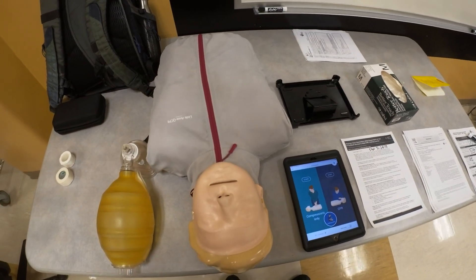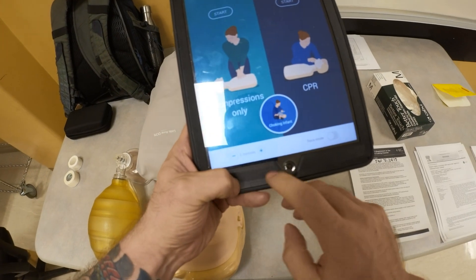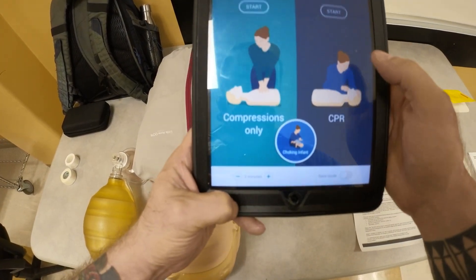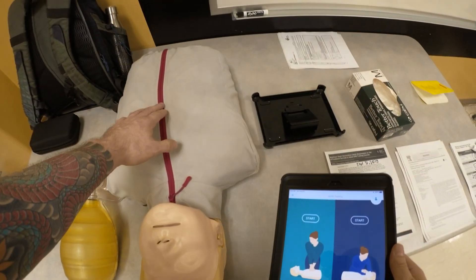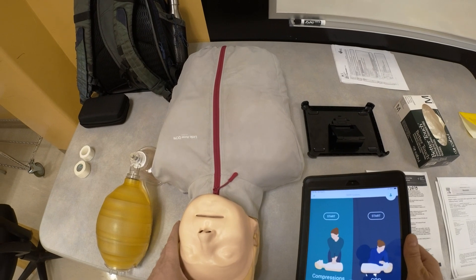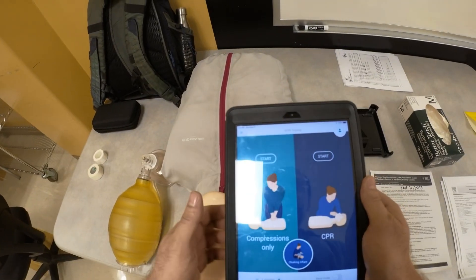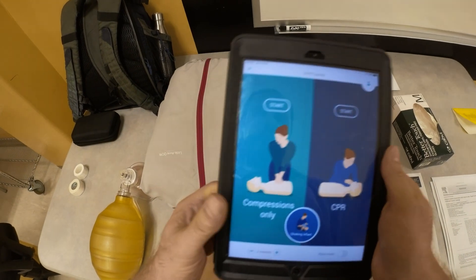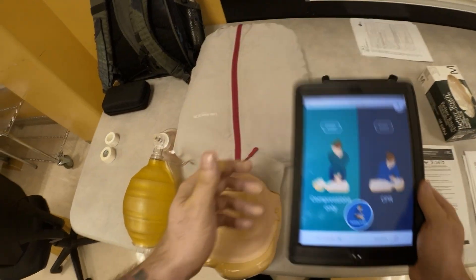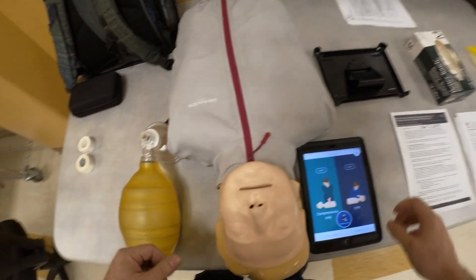I already have my little Annie paired to this device, and I'm going to set two minutes as our code time. I'm going to start CPR and do compressions and ventilations standing at the head, even though this is not the optimal position. I just want to get the data from this app — I want to see my chest compression fraction, my depth, and rate. So we're going to place it here so you can see it, and I'm going to click start.